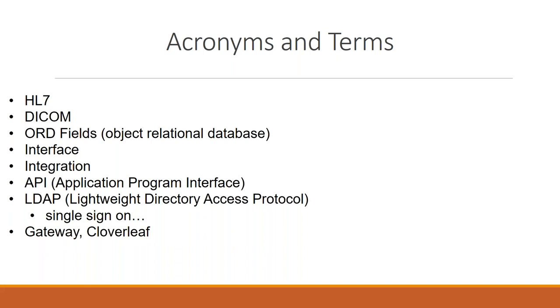It could be your post-processing software. It could be the voice recognition software. It could be your AI software. So there's a number of things that would be part of that. Then you have your Lightweight Directory Access Protocol. That's the one login for everything. That's when the doctors or the groups want to talk about, when I log in, I don't want to have to log into each individual item. So that's called LDAP, is when you'll hear that term.